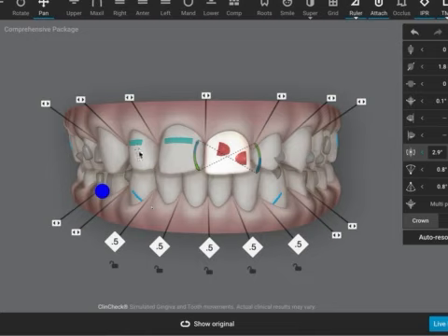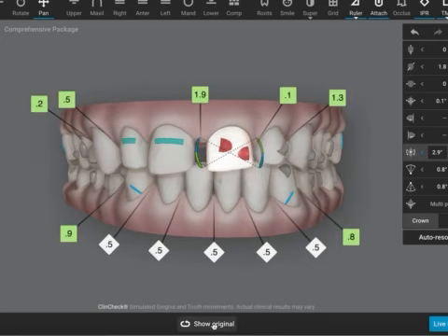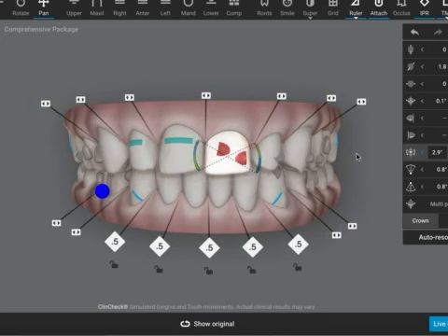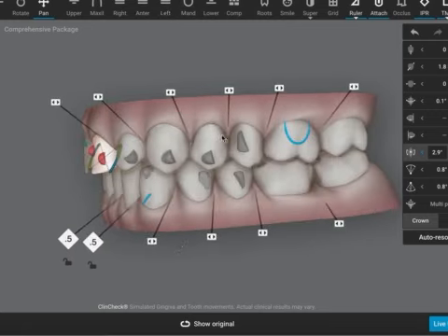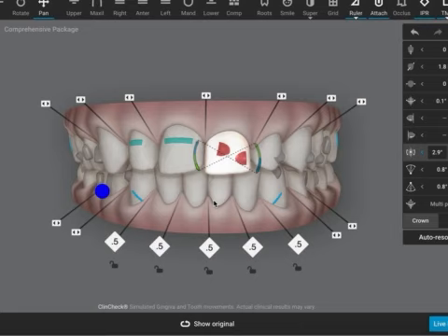I'd also be changing the one-two attachments because they can get squeezed into the aligner if you don't have an attachment on them. Then I'll have a look at the other attachments and movements in detail — I may have to change some of the optimized attachments to conventional. Space closure can be done, but you need a lot more aligners.